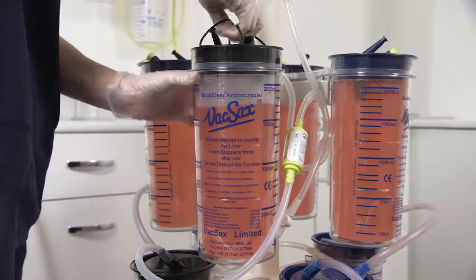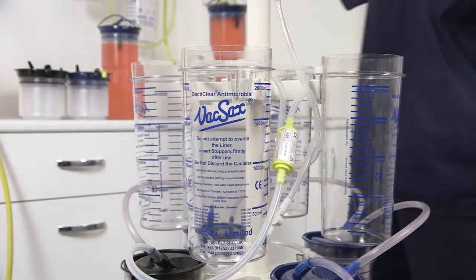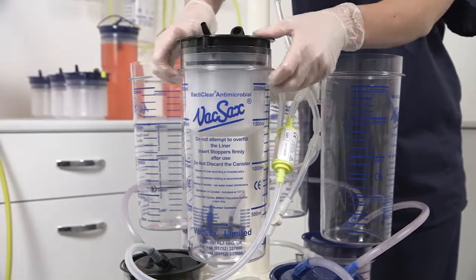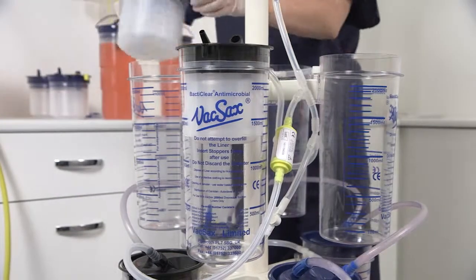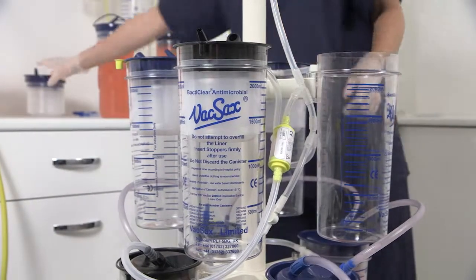Using the convenient handles on each liner, start to remove them from the canisters. Now insert your new liners starting from the left of the controller with the first black cap liner, and connect the cascade tubing.